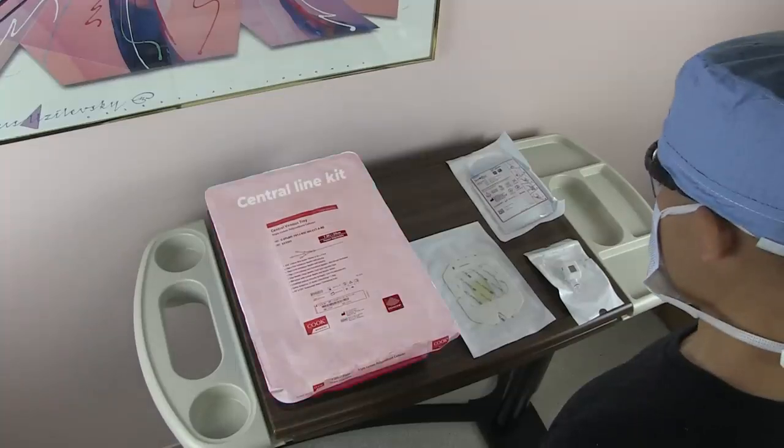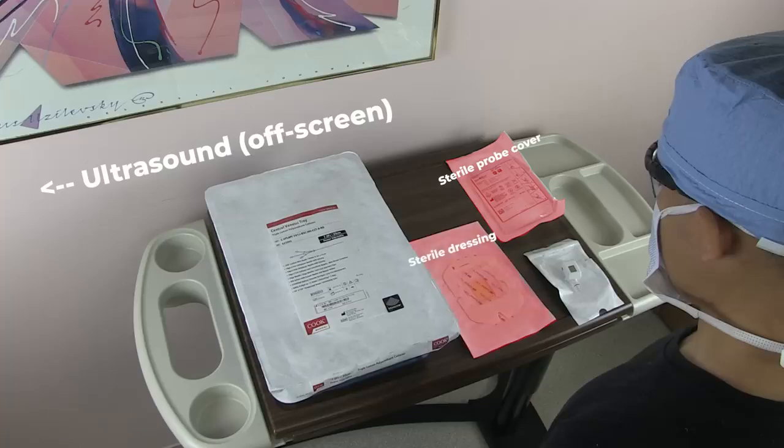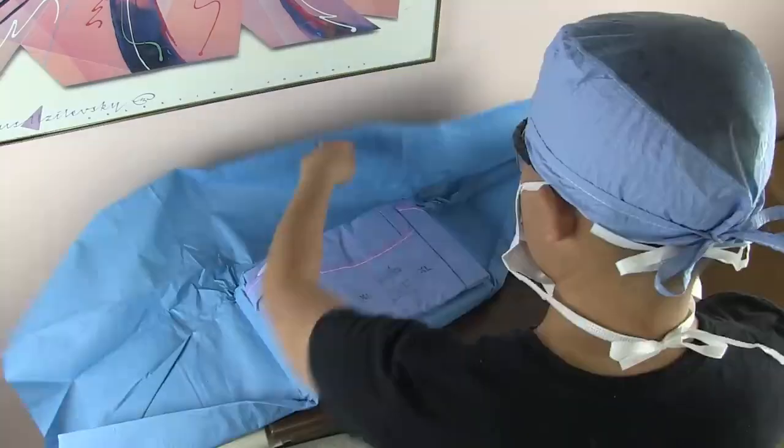Central line kits are awesome and have most of what you need, but there's always something missing, so you have to know what you're getting in the kits. In this case, I also know I'll need an ultrasound, a sterile ultrasound probe cover, and a dressing. I also brought a compass pressure transducer to show you guys. I open up the kit and put on the rest of the included PPE. Alright, let's familiarize ourselves with the rest of the contents of the kit.